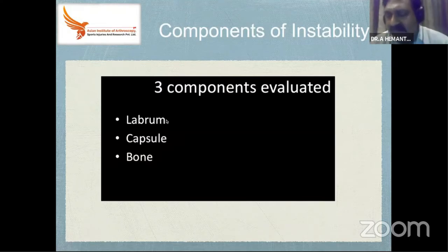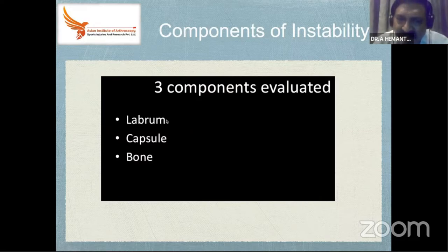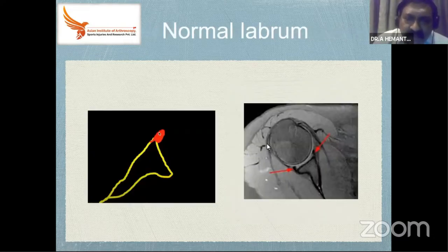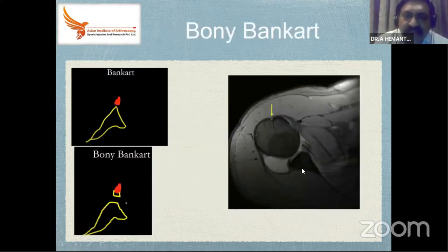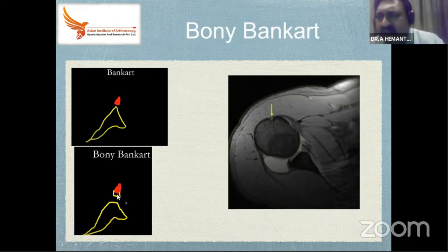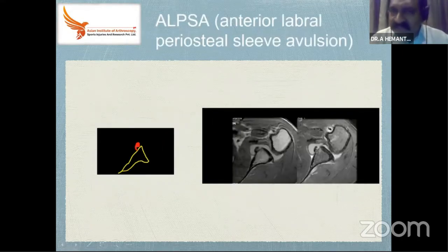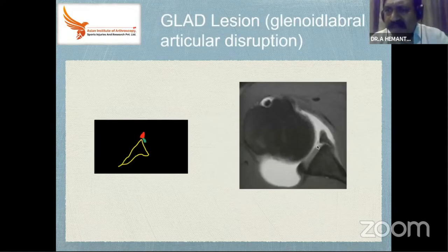In instability, three components must be assessed: the labrum, capsule, and bone. The labrum is a 360-degree structure — we divide it into quadrants or by the clock: one o'clock, three o'clock, and five o'clock. A normal labrum is shown. Then we see a Bankart lesion — lifting of the labrum. A bony Bankart has a piece of bone. There are many described lesions: a Perthes lesion where the periosteum is also lifted along with the labrum, and the ALPSA lesion — anterior labral periosteal sleeve avulsion.